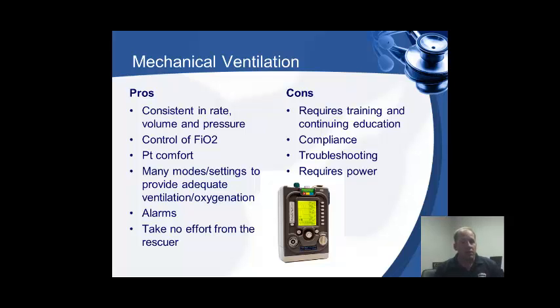There is a decreased ability to feel compliance because now that this thing's ventilating, you don't feel it. If you know what to watch for, those peak pressure settings, some of the other stuff, it'll tell you how your patient's doing on this vent. And you can kind of get a sense of the compliance. And should it change, it should alarm and tell you.